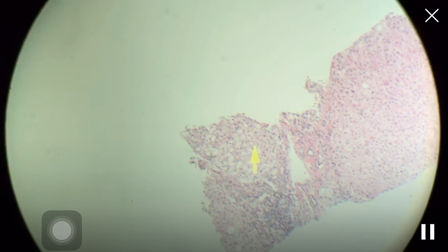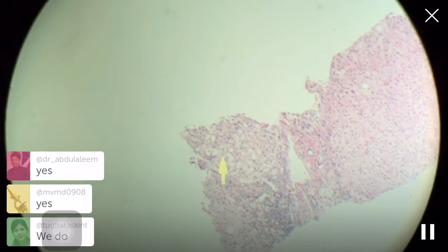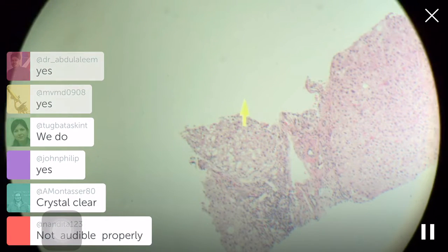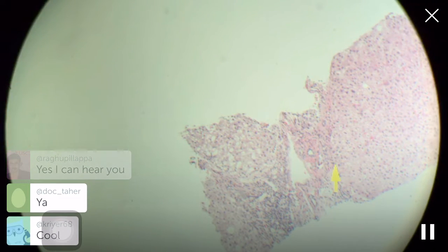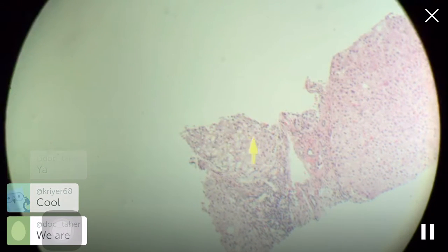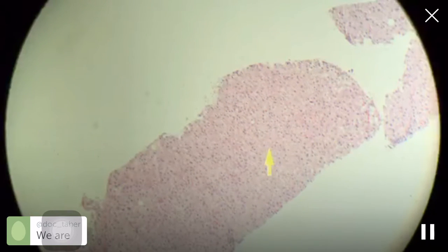So you may be seeing other things in the biopsy already. You can see that there's some inflammation here, and you probably are noticing that there's some scarring. But I'm ignoring those for now because I want to look at those 3 things systematically. And so the first thing I'm assessing is, is there fat in the biopsy? And there is. But notice I have to look around for it. Some areas have a fair amount of fat, and some areas have very little fat.